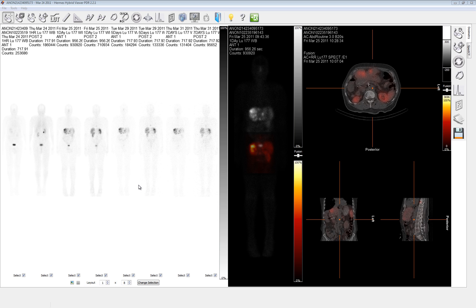The program requires at least three whole body planar images be loaded. The program will also accept a single SPECT or SPECT CT. The use of the SPECT is primarily to account for organ overlap, attenuation, background correction, and when coupled with the CT, the ability to define an organ based on physical dimensions rather than activity uptake.